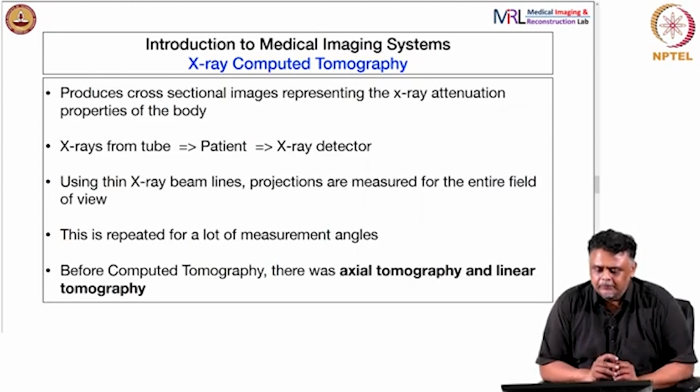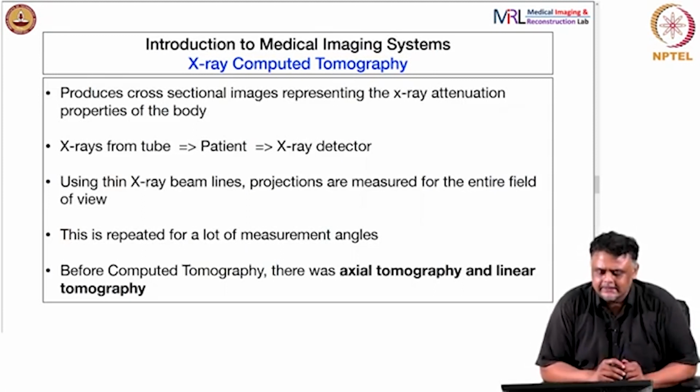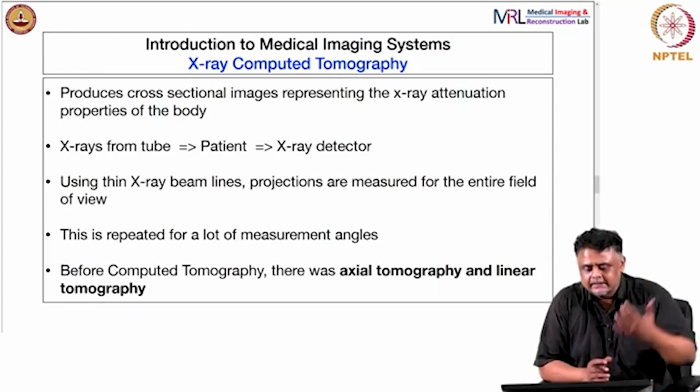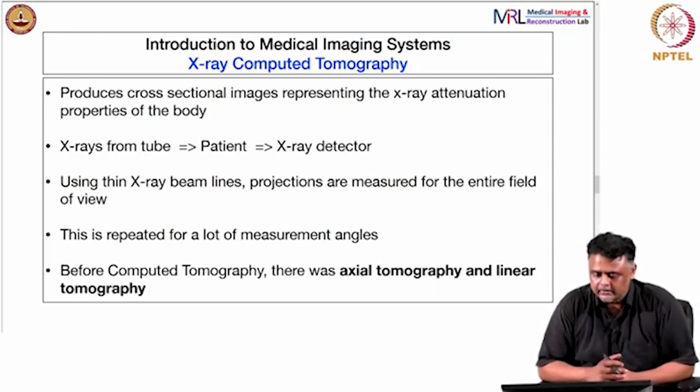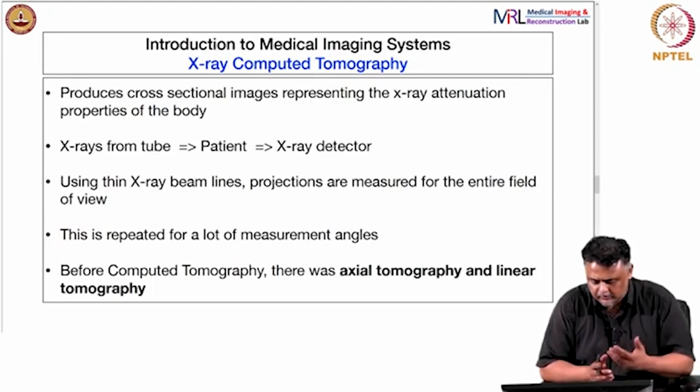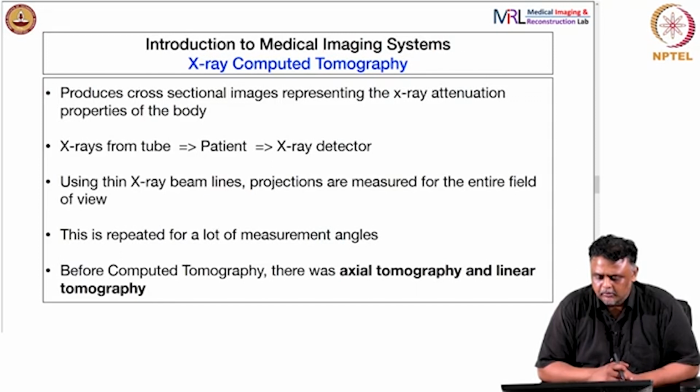Okay. So, we will now move on to X-ray CT or computer tomography. Once again, a most commonly used diagnostic imaging system, one of the most commonly used. Of course, X-ray projection radiography is the most common diagnostic scan that is done all over the world. That's the most common thing, right. People use it all the time, and this is again a fast growing imaging modality in the sense of the number of patients referred, etc.